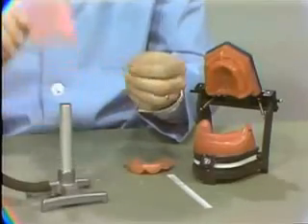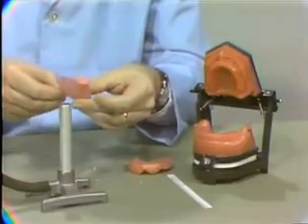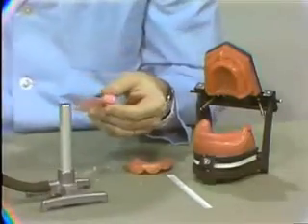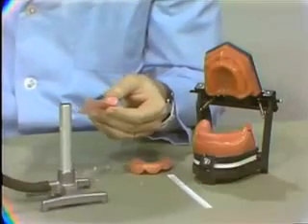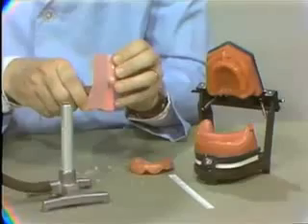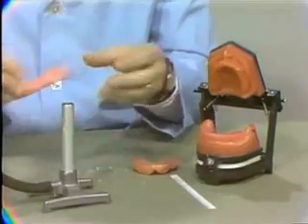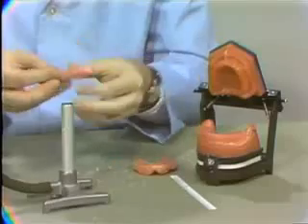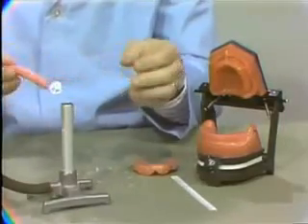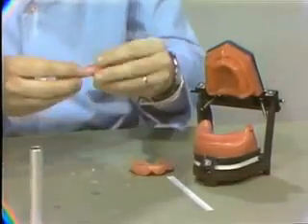Now just about one more fold, and you see I keep heating the wax. I want the whole mass to remain soft. And at this point, we have enough for a roll. I'm going to take a little bit off. I don't want the full sheet of wax. It's not necessary. And complete the heating of the wax mass. Okay, we don't need that for a moment.